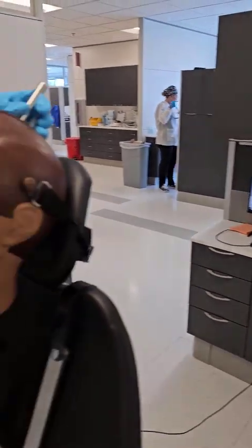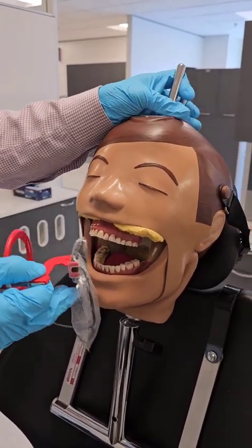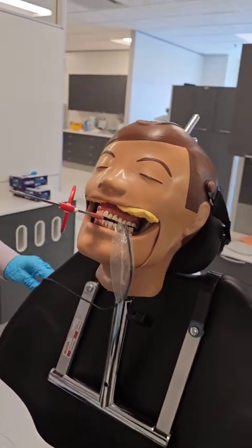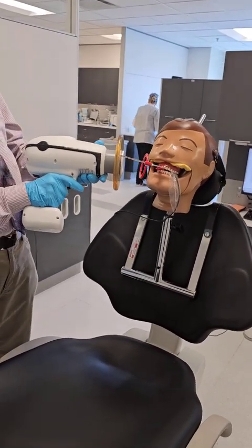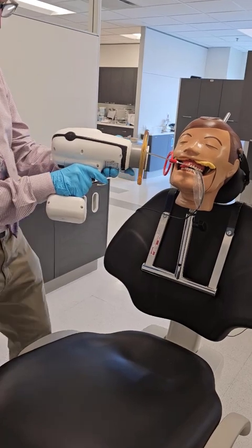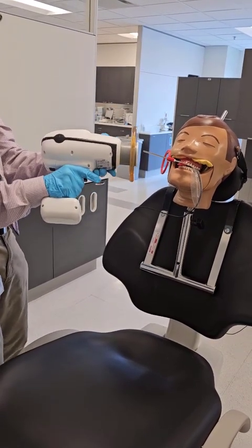I feel like that's coming out — it's sliding up and down. Try to maintain that in the center; that's probably some of our problem capturing too much maxillary bone. Bruce has kind of a stiff tongue which pushes that sensor up when he bites down. So to compensate for that, it'll come down a little bit more. If I'm changing that angulation, I'm going to ignore the ring and aim at the sensor, because the sensor is what's detecting the x-rays, not the ring. So a little bit of negative angulation.